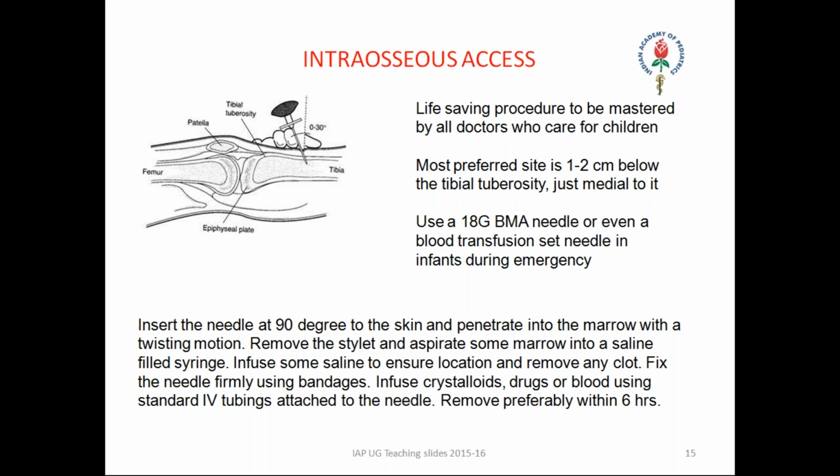Then infuse some saline to ensure the location and remove any clot. After that, you push a small amount of saline to ensure it is in location, there is no swelling. You observe for the swelling and remove if any, and it removes the clots also. Now fix the needle firmly using bandages.